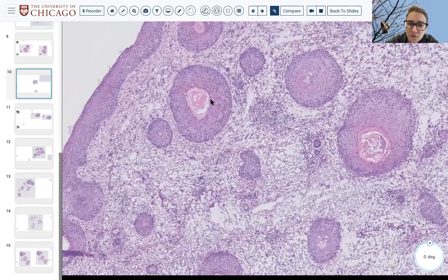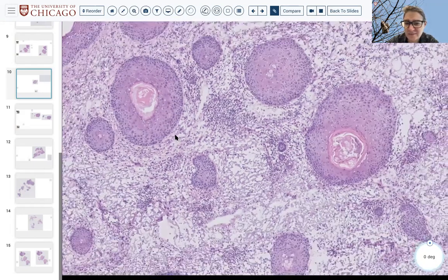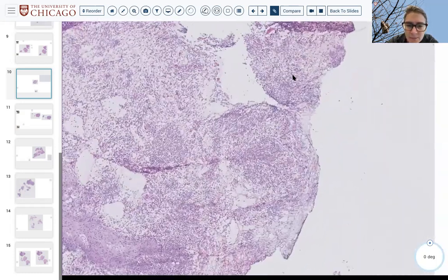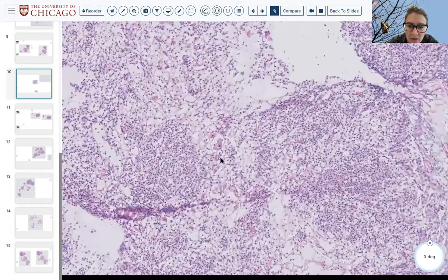When you look at the hair follicles, they kind of have the same atypia. So you're like, okay, what's the hair follicle atypia? Like you're saying, what's carcinoma? It's all very inflamed. Well, let's keep looking. Don't give up just based on that. Always look deep.